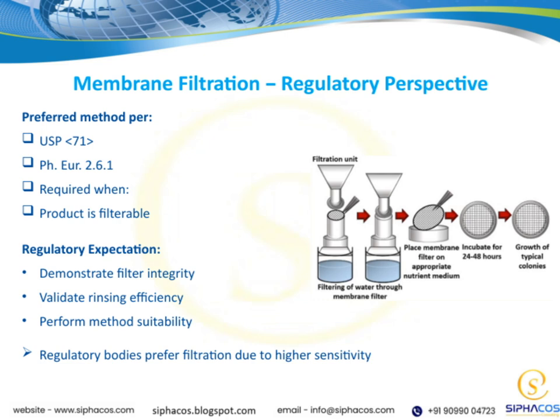From a regulatory standpoint, it's essential to demonstrate the integrity of the filter, showing that it's working properly and effectively. Additionally, you need to validate rinsing efficiency, ensuring that the filtration process doesn't leave behind contaminants or residues.